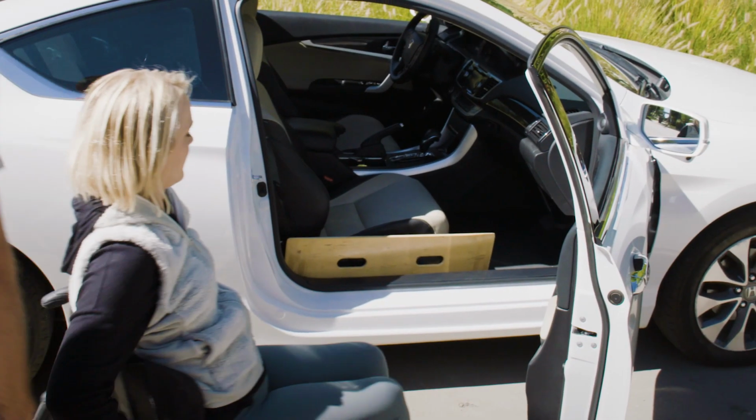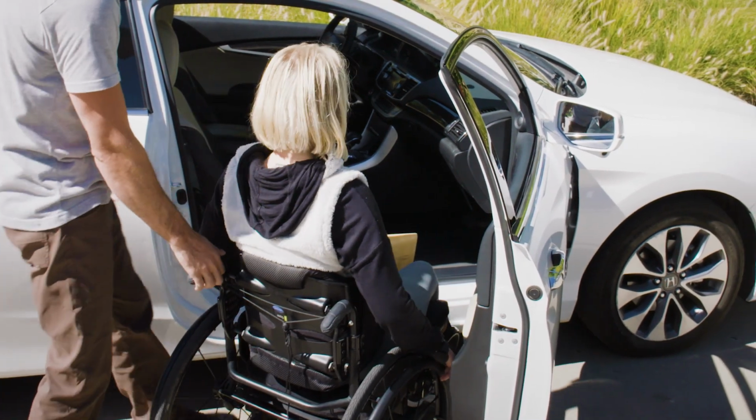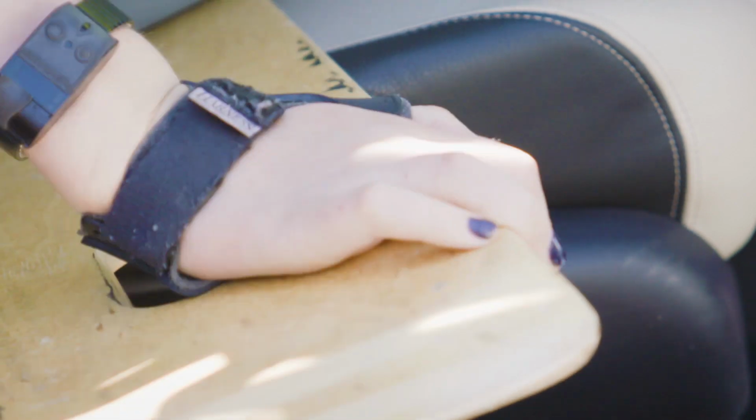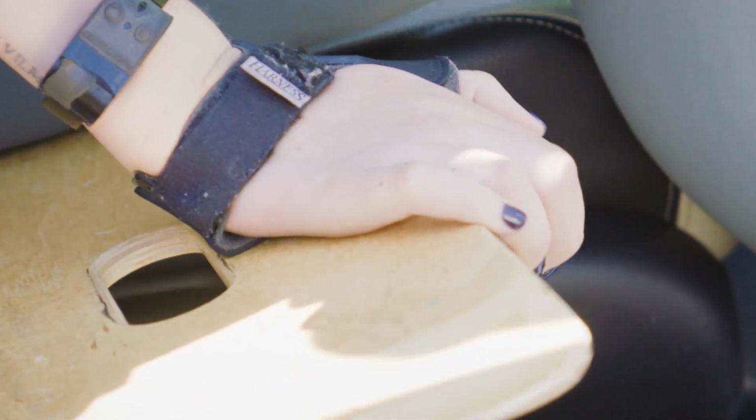The transfers in this video will demonstrate the use of a 29-inch slide board to assist the manual wheelchair user to enter and exit a car. These transfers are not usually done from power chairs. This is because power chairs are usually only transported in wheelchair-accessible vehicles.